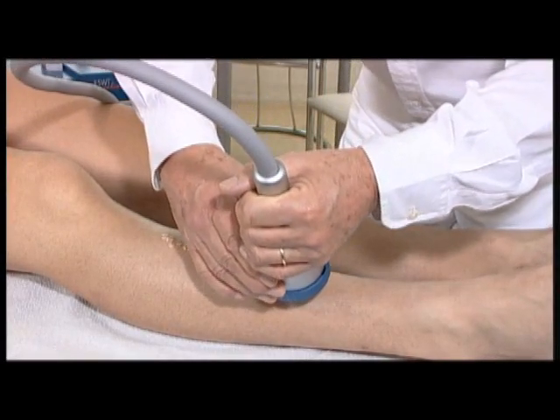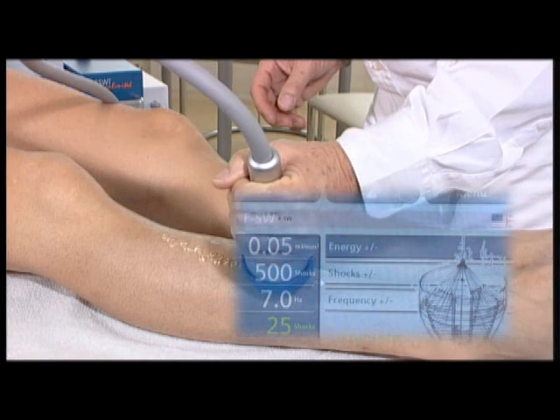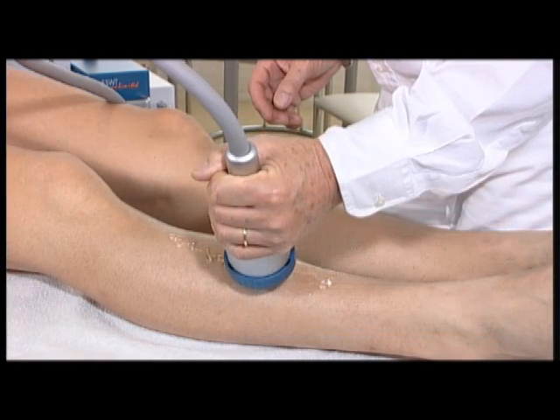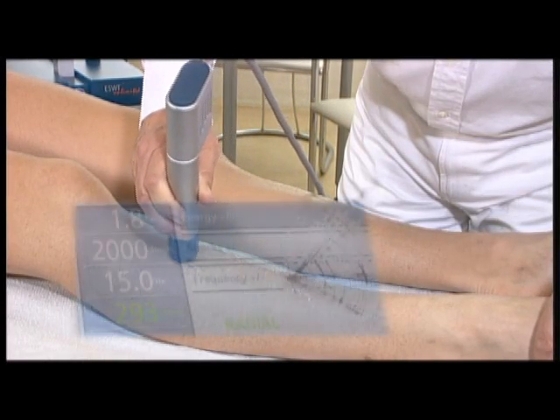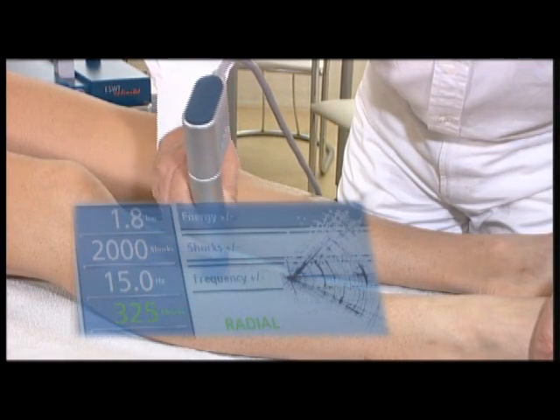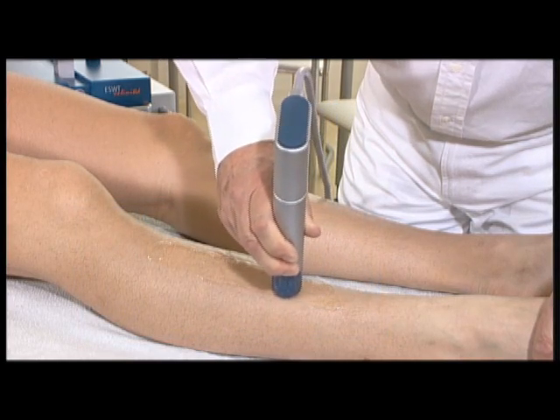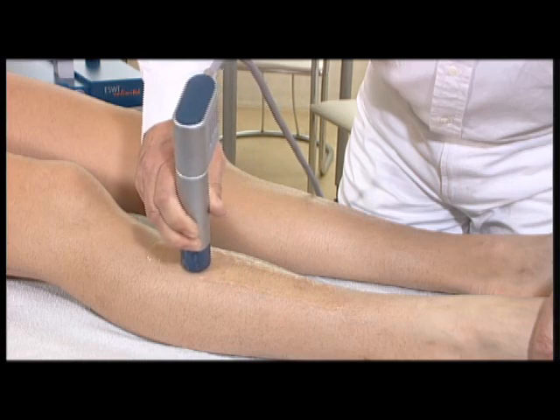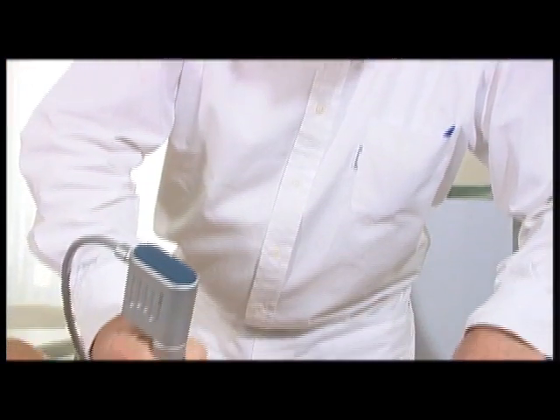In the treatment of the tibial stress syndrome, focused shock waves are used to diagnose the pain regions along the tibia. Hier an der Stelle? Ja. Gut. Das können wir jetzt durchbehandeln. Treatment is then performed by applying radial pressure waves laterally along the inside border of the tibia. Möglichst mit diesem Gerät nicht an die Schienbeinkante kommen, das tut weh. Adjacent muscles must be stretched during pressure wave application.